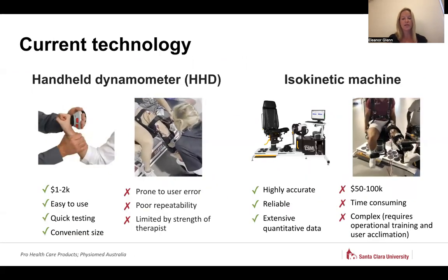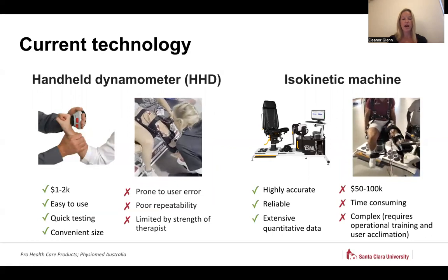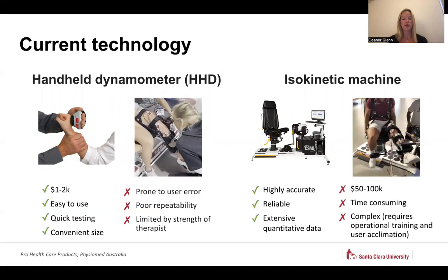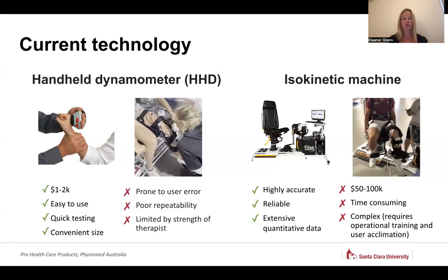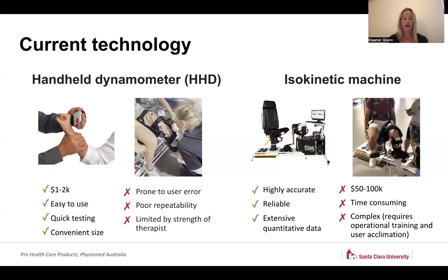Currently, the most common devices used to test muscle strength are the handheld dynamometer and the isokinetic machine. These two options have a large gap in both price and performance. The handheld dynamometer is much cheaper, but lacks accuracy compared to the isokinetic machine, which is considered the gold standard for muscle strength testing. The testing protocol for the handheld dynamometer is user-friendly, quick, and convenient. These factors are important when dealing with large groups of athletes, so trainers often opt for the handheld dynamometer even when they have access to the isokinetic machine.